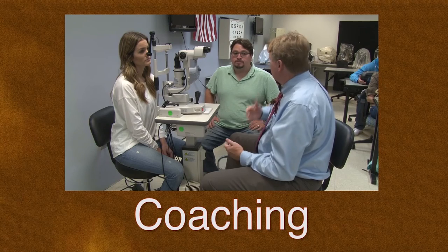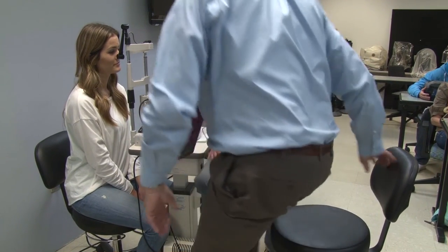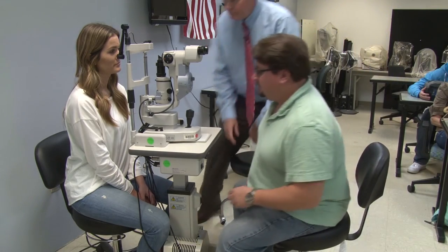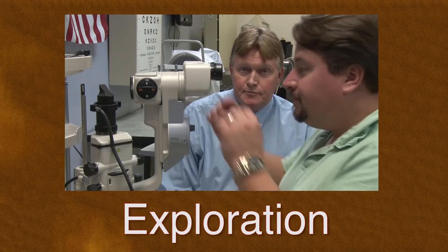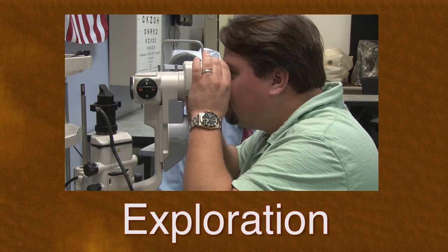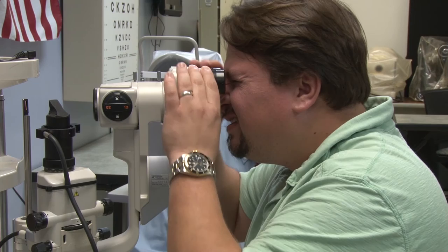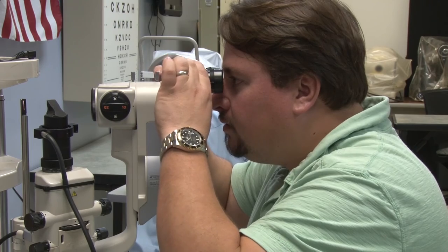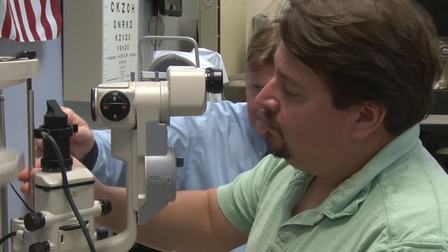Coaching or scaffolding involves providing the mentee with verbal support of cognitive activities needed to perform a competency. For this competency, the mentor would now allow the mentee to perform the slit lamp exam. The mentor will provide suggestions on techniques and clarify understanding. Exploration involves giving the mentee room to solve problems on their own. The mentor slowly withdraws support and allows the mentee to perform the competency independently, though the mentee should be supervised closely prior to performing the exam on their own.